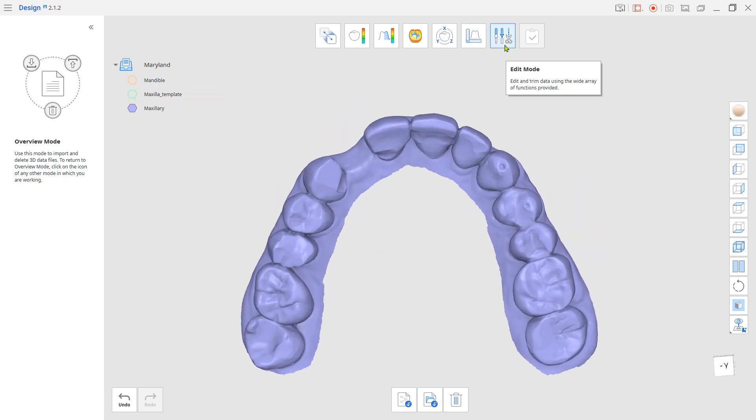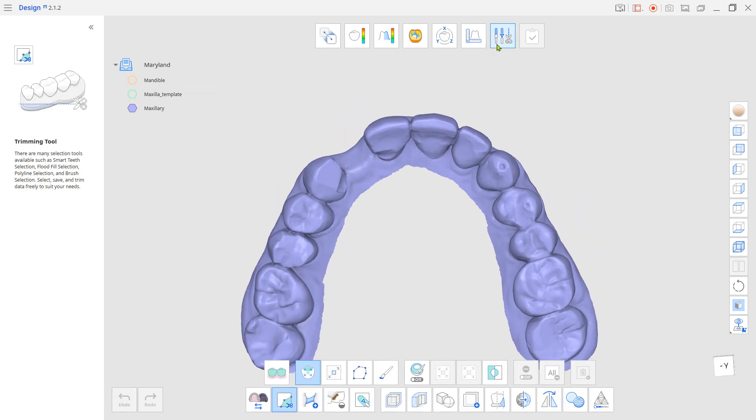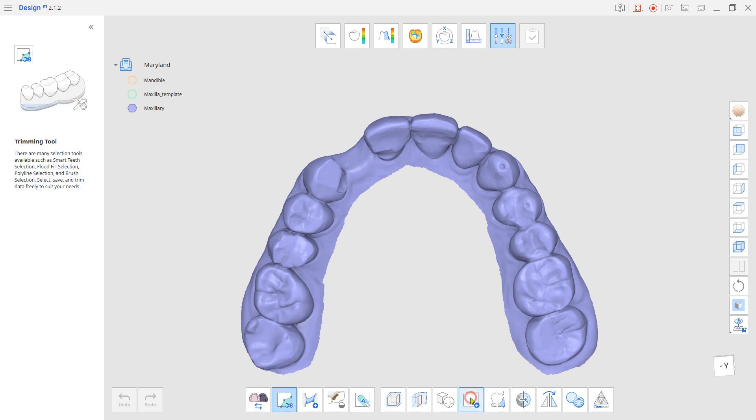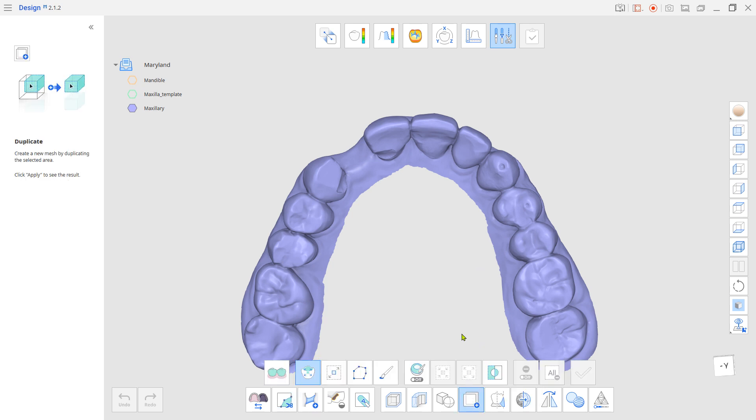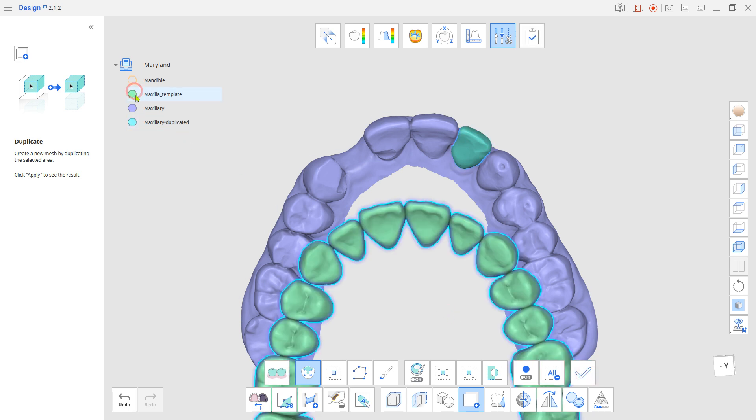Go to Edit Mode. Duplicate and mirror the missing teeth from the other side. If there aren't any, use your teeth library for reference.